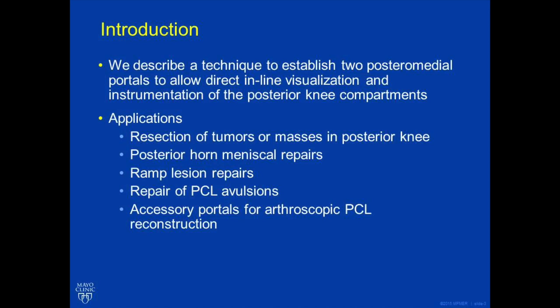Here, we describe the technique for establishing dual posterior medial portals for complex arthroscopy in the posterior knee, specifically in relation to a case of a posterior knee mass biopsy and resection.